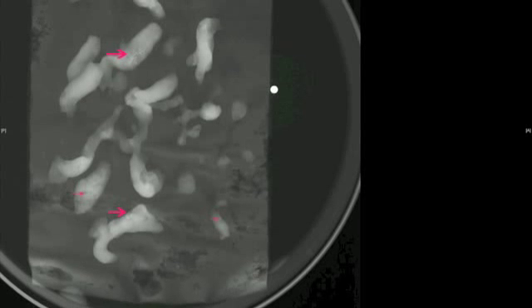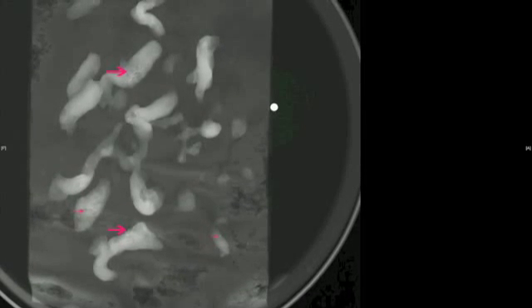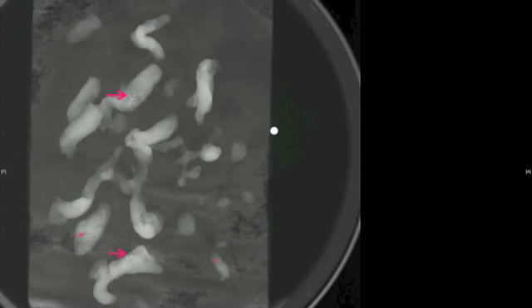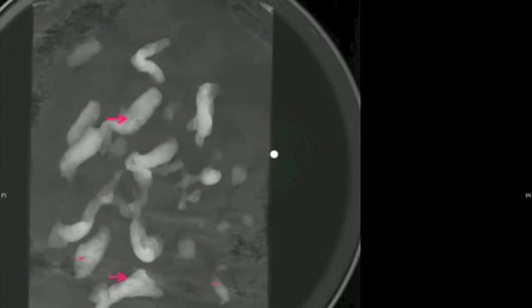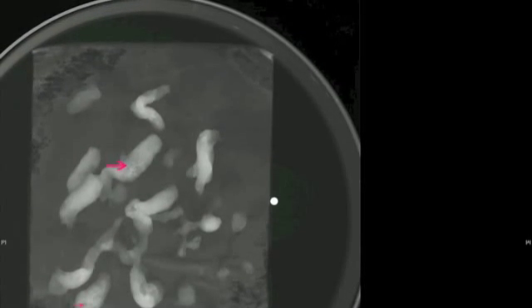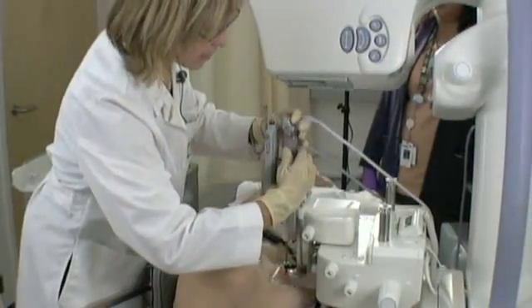This is the specimen radiograph, obtained while the patient is still on the table. It confirms the presence of targeted microcalcifications in multiple samples. The samples with microcalcifications are placed in a formalin jar separate from the samples without microcalcifications, and all of the tissue is submitted to pathology. The specimen radiograph showed beautiful calcifications in the samples.